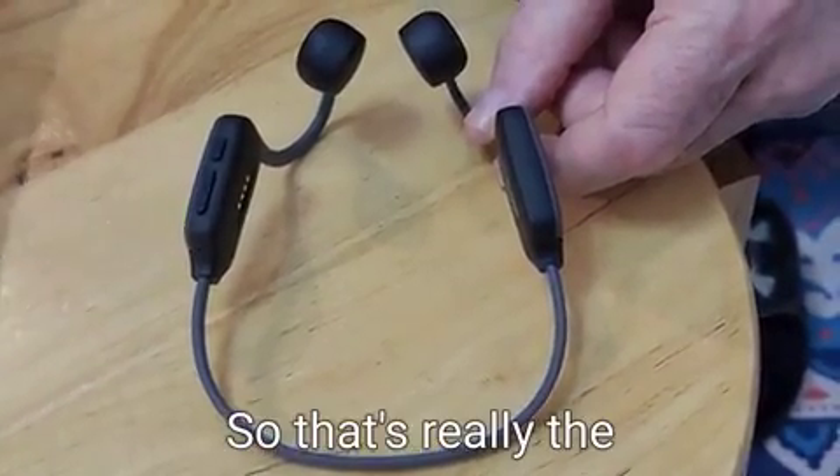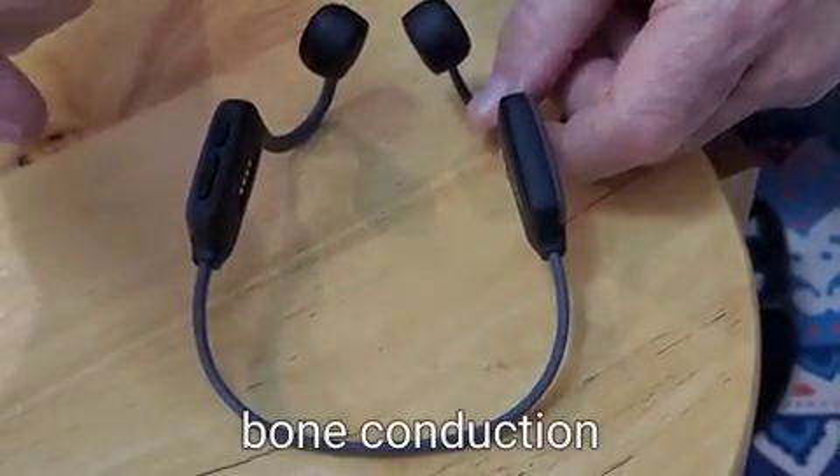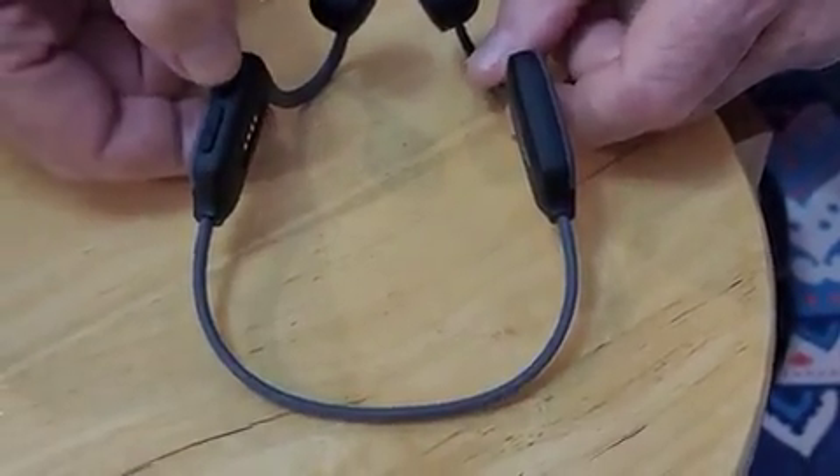That's really the way you use the two functions: Bluetooth bone conduction headphones and hearing aid bone conduction. Thank you.